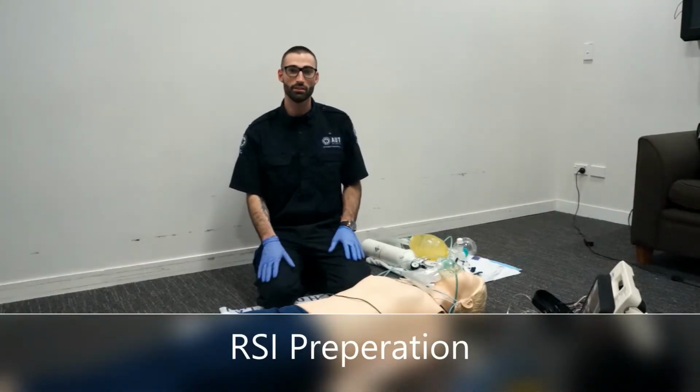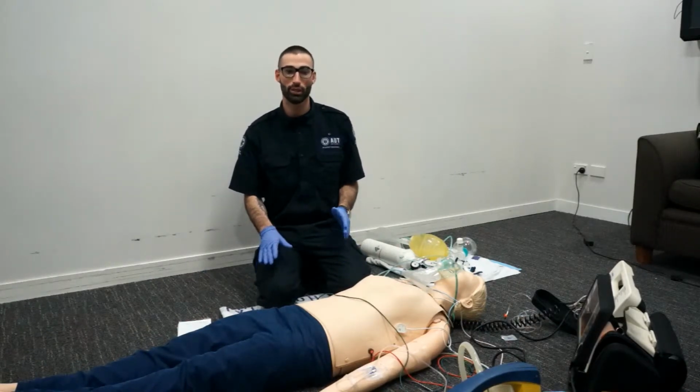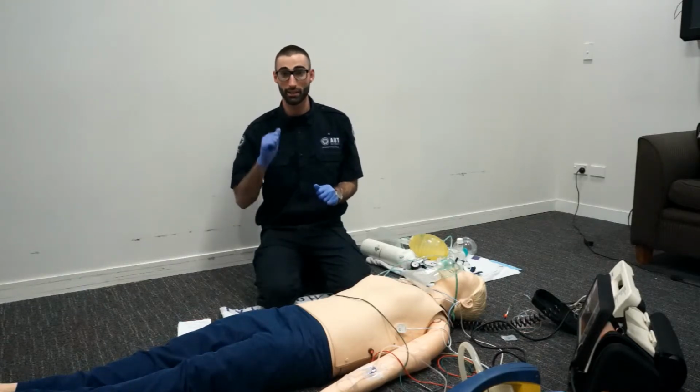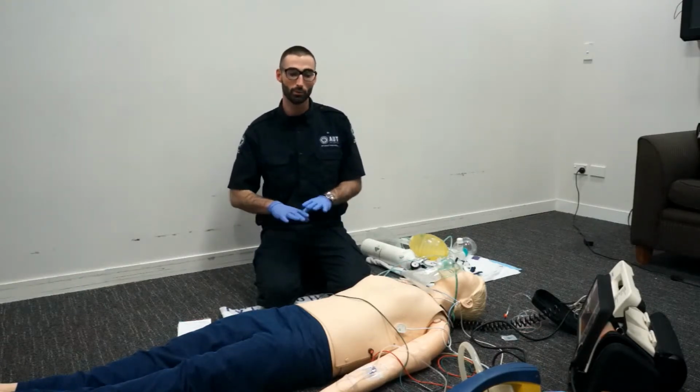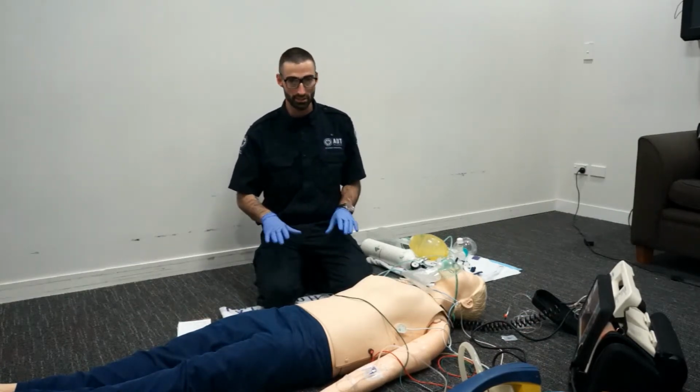Hey, I'm Chris, and this is my RSI preparation checklist OSCE for ILS. We've been called to a 30-year-old male patient who's fallen out of a tree at approximately a height of 4 meters. He's landed on his back and hit his head. On our arrival, we find him lying flat on his back. He has altered LOC. His ABCs are clear.